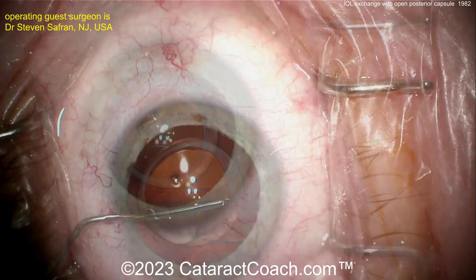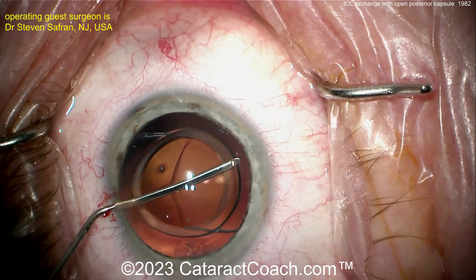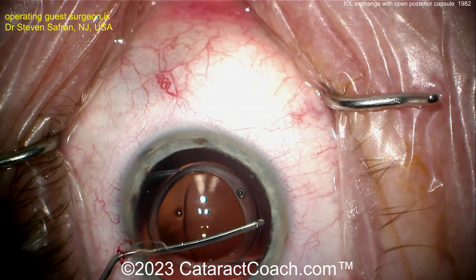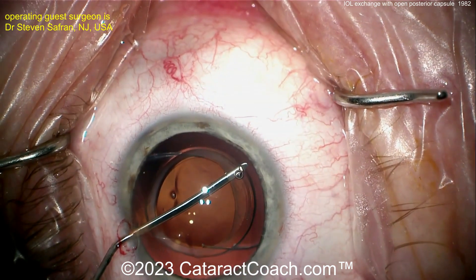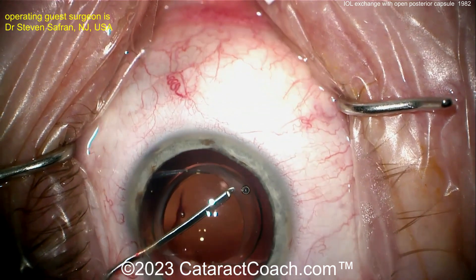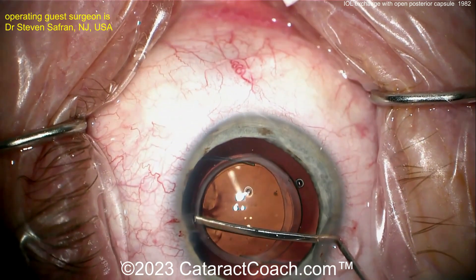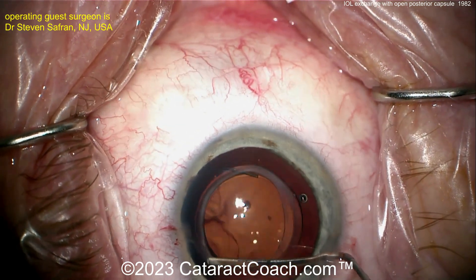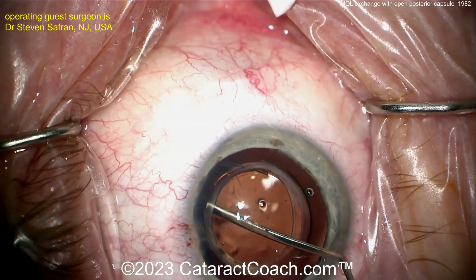The first step is making the incision, placed more anteriorly than the original so the two don't intersect. Now using a dispersive viscoelastic agent to separate the anterior and posterior capsule leaflets. You want to see that fluid wave of viscoelastic going behind the optic — the goal is to separate the optic so it can be removed from the capsular bag.